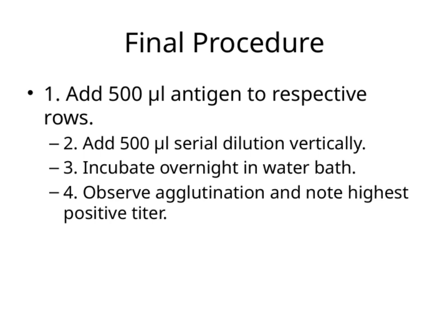Finally, the next day, observe the plates carefully for agglutination. The key here is to note the highest dilution level where agglutination still occurs. That's your highest positive titer. This process is crucial because it helps us quantify the antibody levels in the sample, tying back to our overall goal of understanding immune responses.